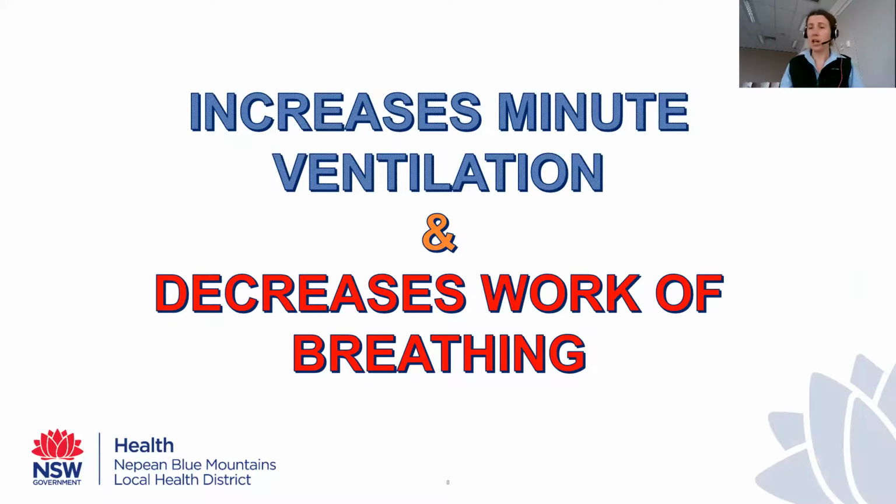Now, minute ventilation has a direct correlation with CO2. So PEEP, positive end expiratory pressure, the pressure we apply at the end of expiration, helps with oxygenation. Minute ventilation helps with CO2. In addition, adding in an inspiratory pressure helps decrease the work of breathing. It helps our patients take a bigger breath to achieve that minute ventilation that their body needs. And so often it can actually slow their respiratory rate down.